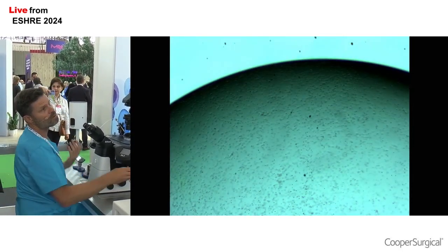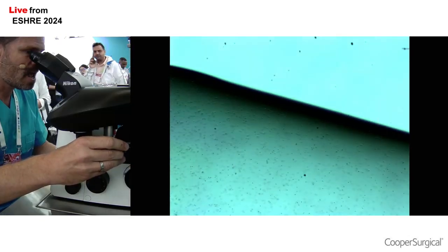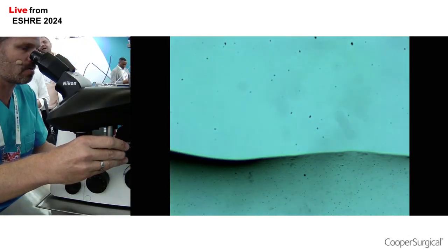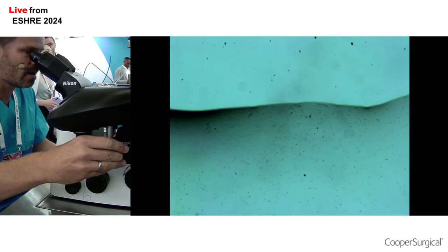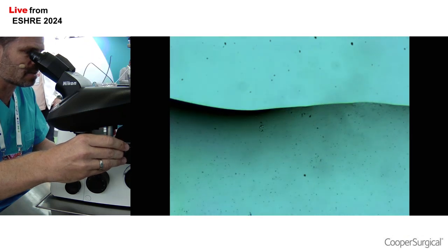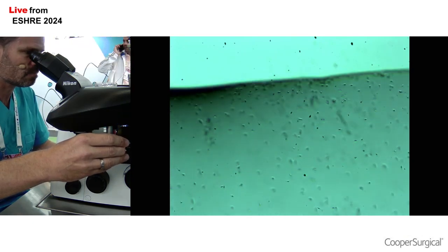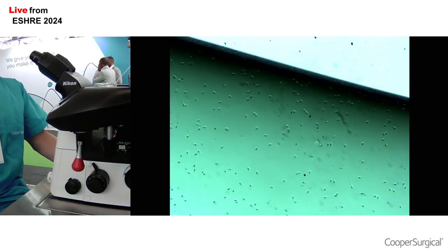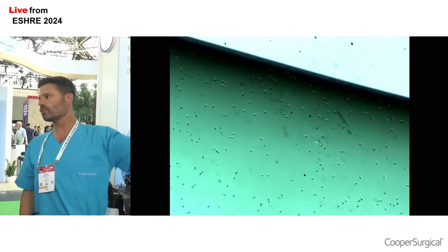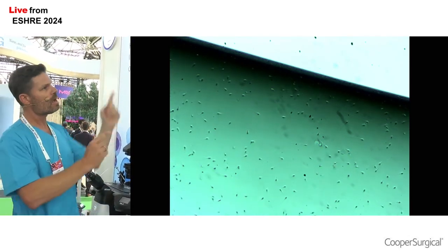I actually probably prepared the concentration a little bit too high for today, but we'll see how we go. And I'm going to go along this drop, and if I follow the edge of this drop along here, eventually I'll get to the area where the media contains hyaluronic acid, which is the SpermSlow. So let's go up to a higher magnification. Hopefully what you can see here, we have really good motility. The sperm swimming freely with a progressive motility.